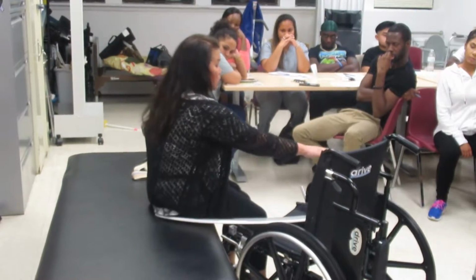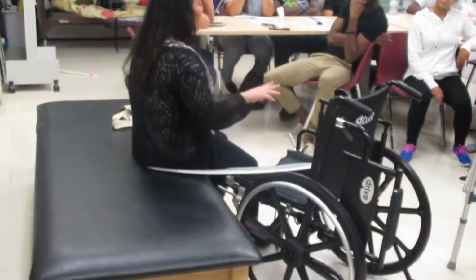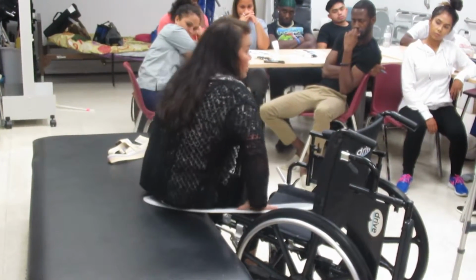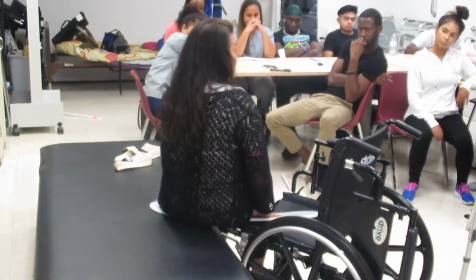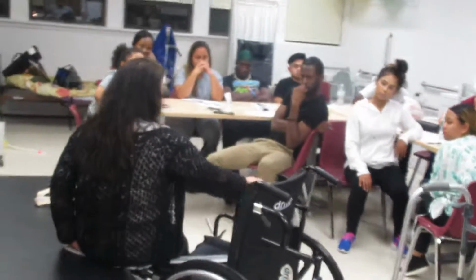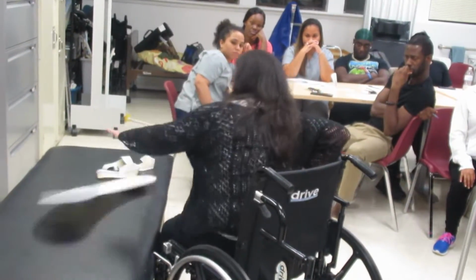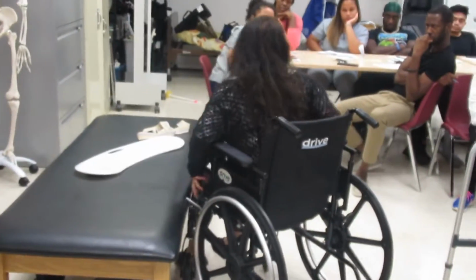Same thing, you want to either reach here or have their hand here for the first slide, because it takes more than once to get into the chair. Slide over. If the chair moves, have someone hold it. Usually the therapist does. If I'm the therapist and I'm working with my patient, I'm right in front of my patient. For the slide board transfer, the therapist is always in front. Grab this, keep sliding over. I never have to lift myself up during a slide board. You want to teach your patient to be able to manage as much as they can on their own.